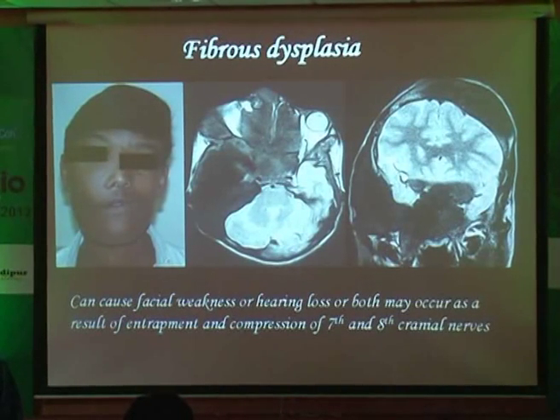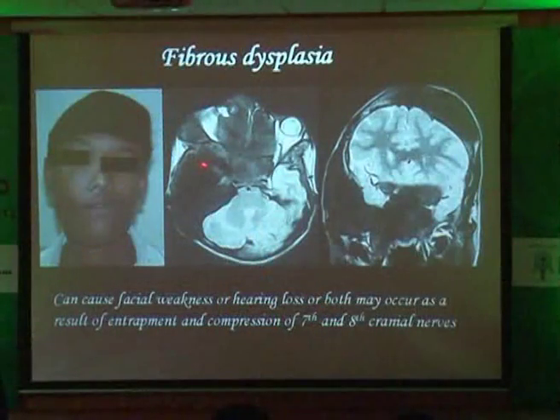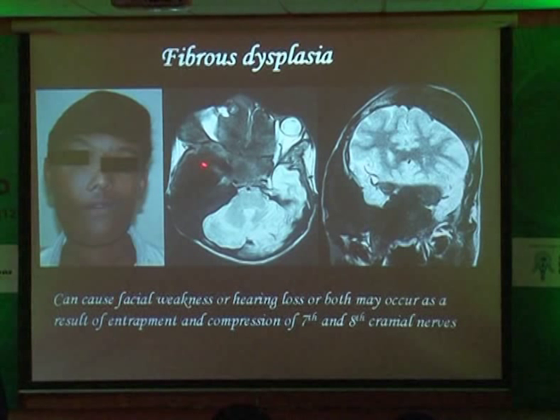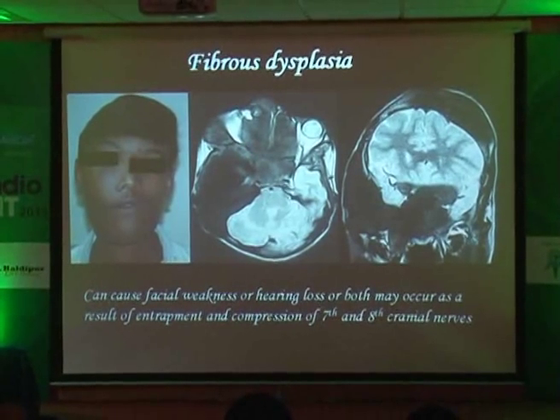Fibrous dysplasia looks ghastly on MR because it contains fibrous tissue, which contains less water. Since MR is sensitive only to hydrogen, fibrous dysplasia appears dark. Only when there is hydrogen does it look bright. Look at this: there is a large fibrous dysplasia involving the petrous temporal and the ethmoids. This patient was deaf and also blind on the right side — not just due to 7th and 8th nerve involvement, but the optic canal was also encroached upon by fibrous dysplasia. So look beyond the temporal bone.